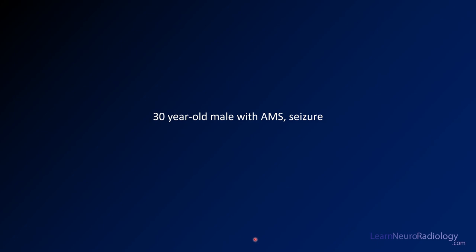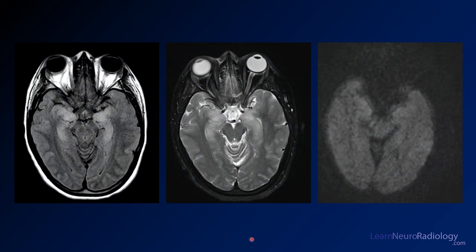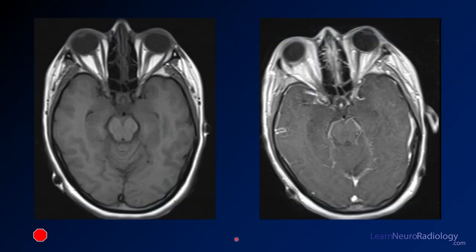We're going to start with a 30-year-old male with altered mental status and a seizure. Here you see some images from a patient who's altered. We have a FLAIR, a T2, and a diffusion. You want to look at the FLAIR pretty closely. When you're talking about someone with encephalitis, you want to think about those medial temporal lobes. You can confirm that abnormality on the T2. The diffusion is pretty normal. Here's your pre and post contrast — pre-contrast on the left, post-contrast on the right. You're not seeing a lot of enhancement there.